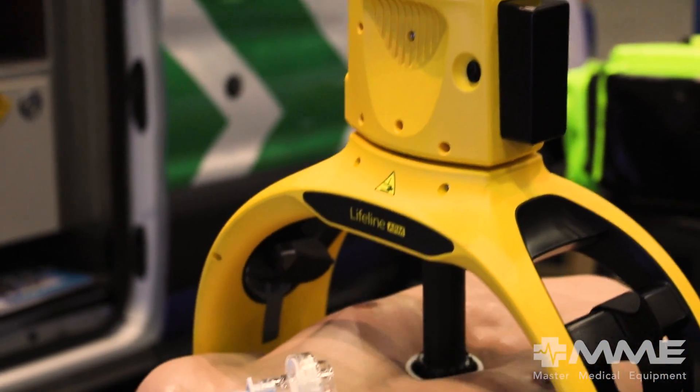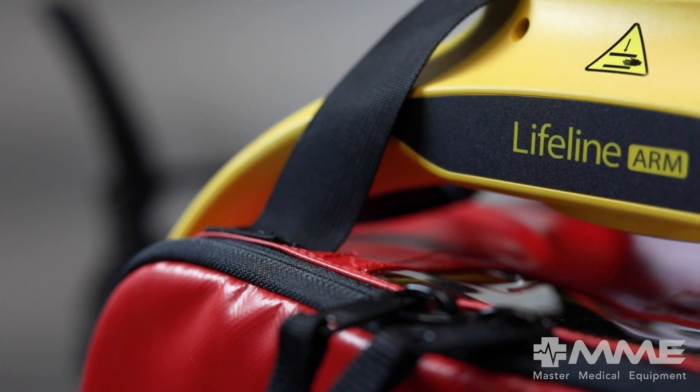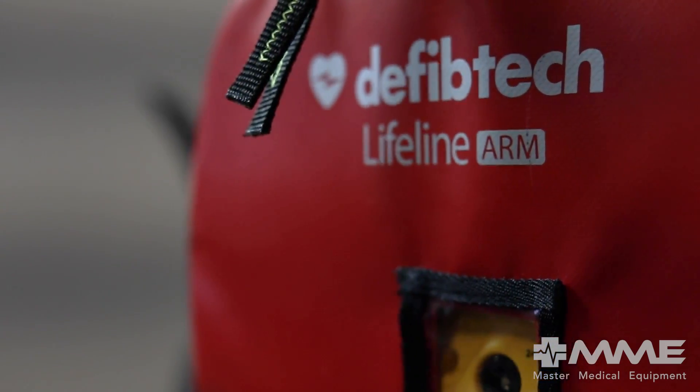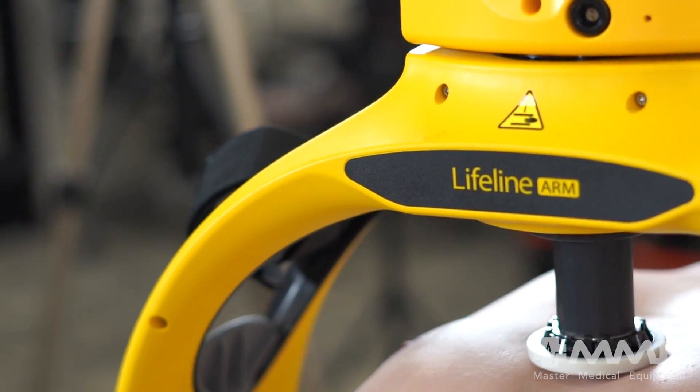Hi, I'm Katherine from DeFibTech, here to give you an in-depth look at the Lifeline Arm, DeFibTech's automated chest compression device. The arm's efficiency and ease of use are designed to save time during rescues and provide top-of-the-line life-saving chest compressions.